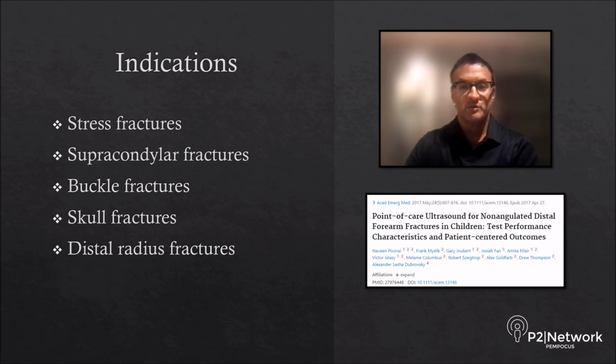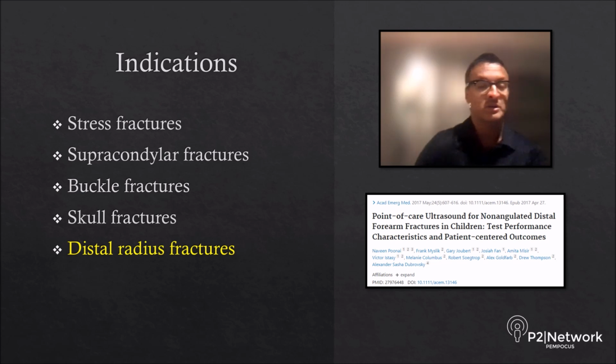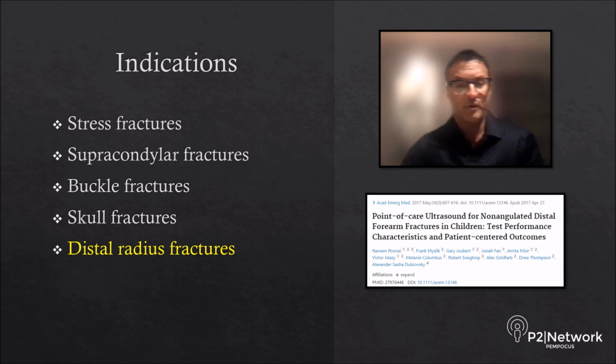So POCUS can be used for a vast number of indications for fracture management. These are just a few of them. Stress fractures, supracondylar fractures, which are specific to pediatrics, of course. Buckle fractures or torus fractures, skull fractures, and my personal favorite, distal radius fractures.